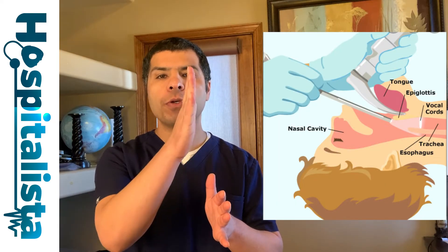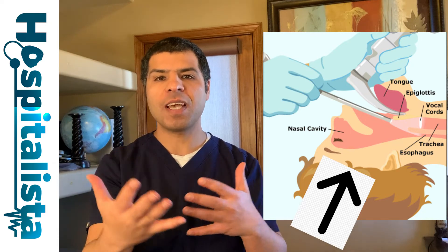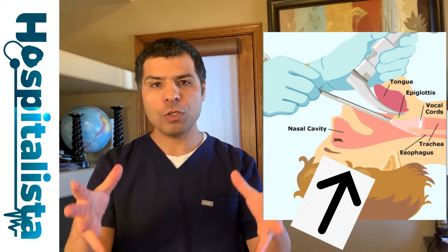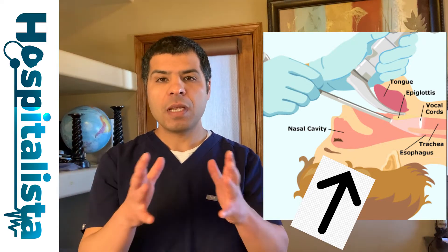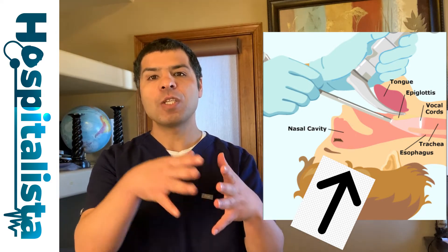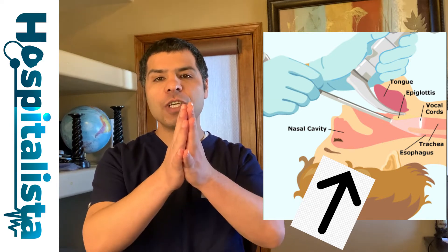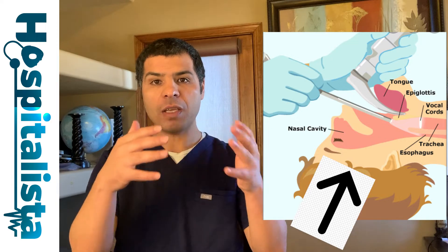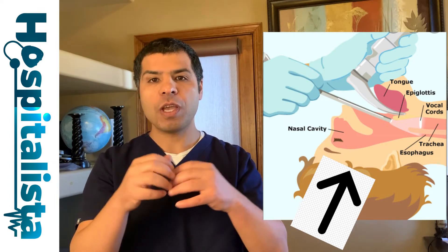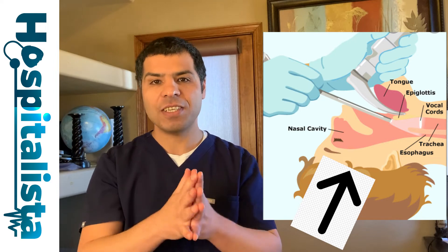The job of the laryngoscope is to move the structures — mainly the tongue, the mandible, and the epiglottis — anteriorly and superiorly. This way we can expose what's underneath the epiglottis, which is the glottis and the vocal cords, so we can insert the endotracheal tube. The anatomy and shape of the laryngoscope should follow this anatomy to allow us to make this movement, clearing these structures from view, so you can visualize what's underneath and insert the ET tube.